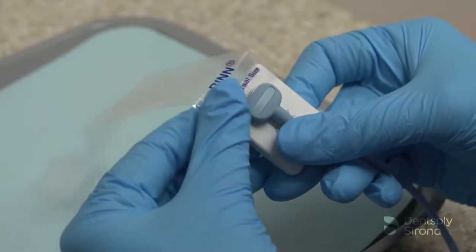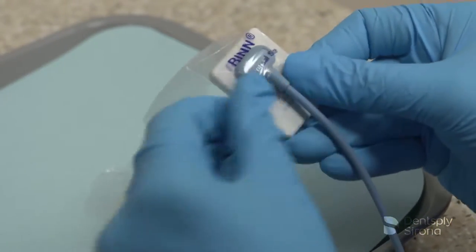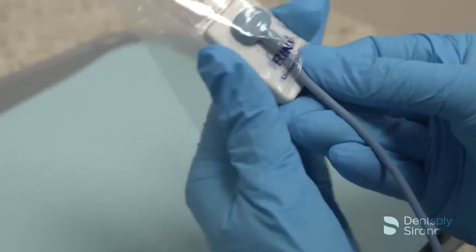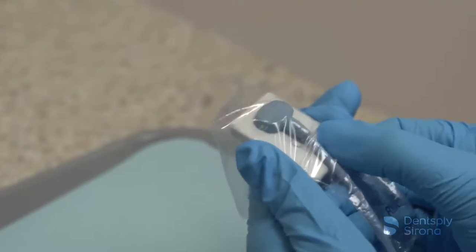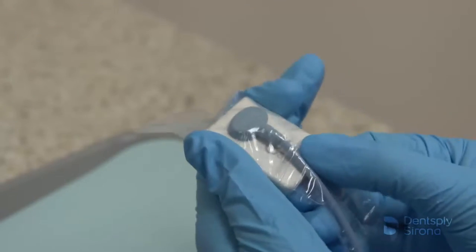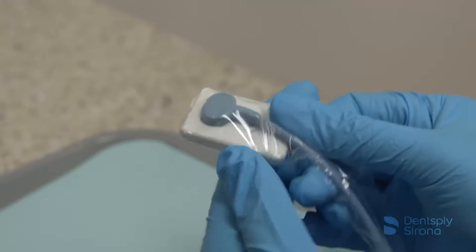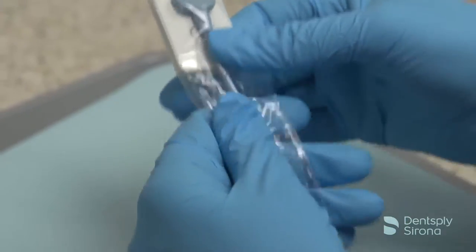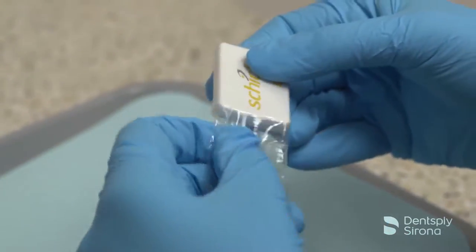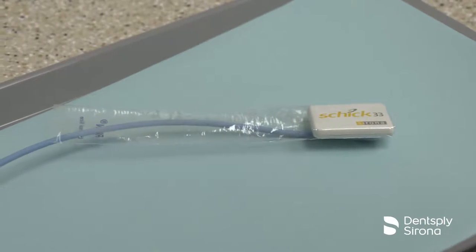To assemble the UniGrip 360 for use, insert the sensor into the opening of the RIN Universal Cover. While holding the sensor at the bottom with one hand, begin sliding the cover down over the sensor until it reaches the top of the cover. Do not push or pull on the cord to place the sensor into the sensor cover. Use of this barrier does not replace the cleaning and disinfection of digital radiology sensors. Please clean and disinfect digital radiology sensors as described in the manufacturer's directions for use manual.